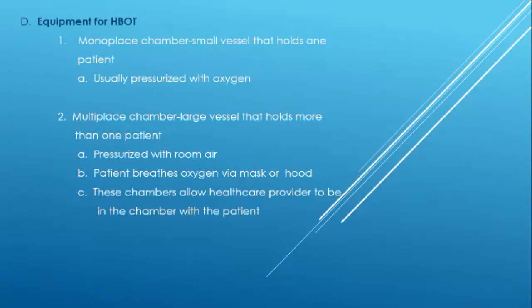Now the monoplace, since you're the only one going in, you don't need an oxygen mask. We can pressurize the whole room or the whole unit with pure oxygen. And so now, you're the only one getting the effects, and I'm sitting on the outside watching you, okay?